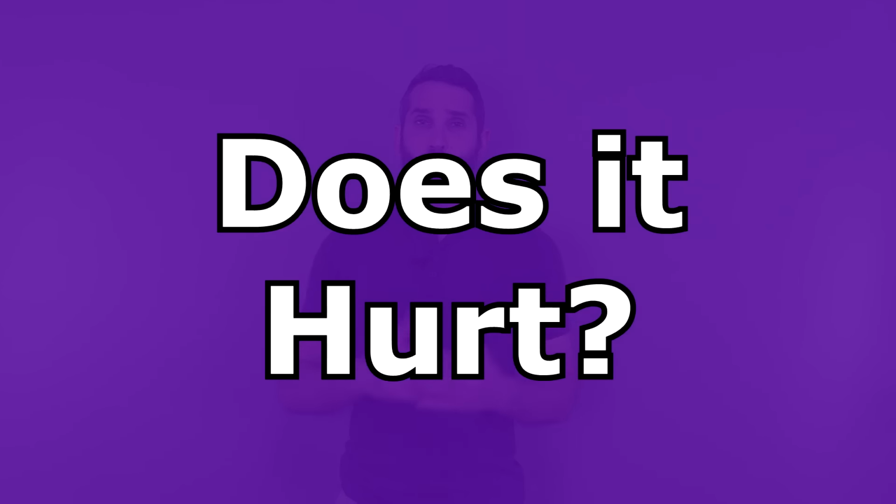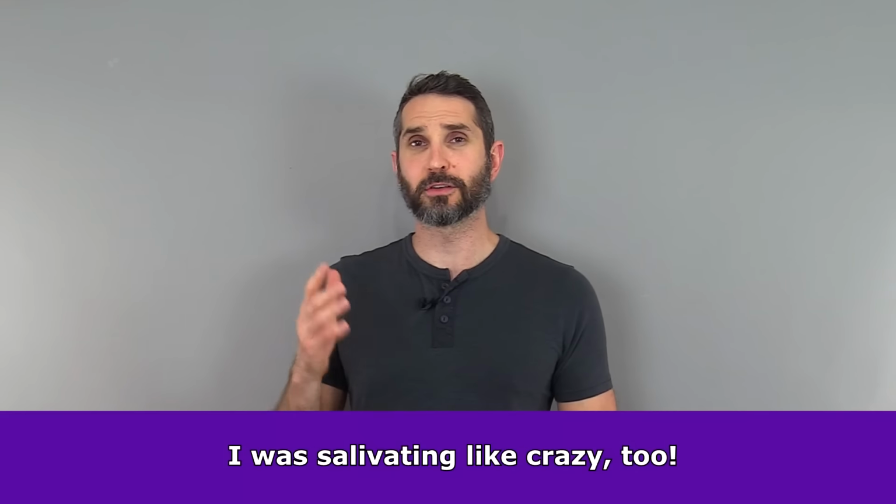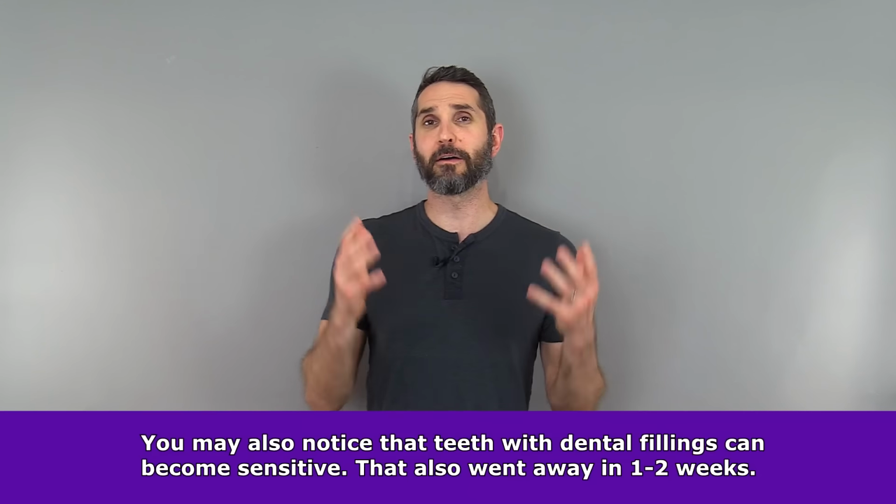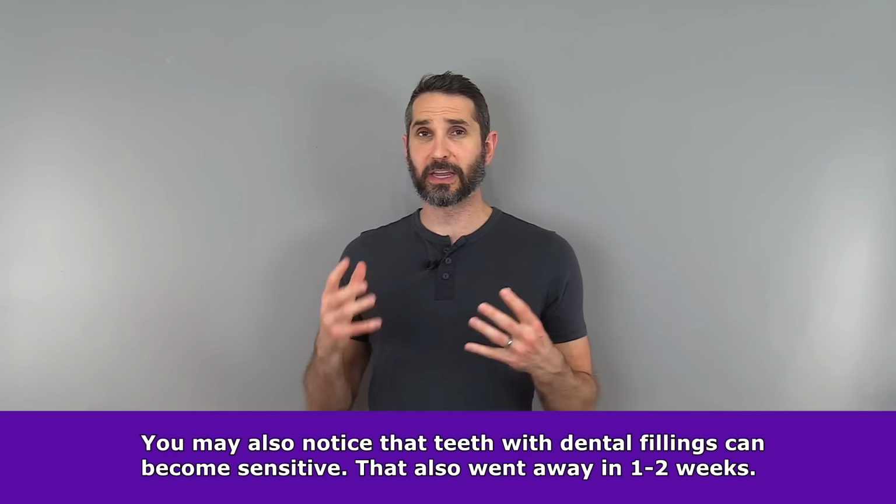Another big question that people have is, does this hurt? And the good thing about this clear aligner treatment is that they use a much gentler approach than traditional metal braces, but there is still some pain involved. The worst of it for me was definitely that first 4 or 5 days because my whole mouth completely freaked out. And I had a serious moment of regret where I was thinking to myself, this is the worst decision ever. But thankfully, after about 4 or 5 days, my mouth and everything adjusted, the pain began to subside, and things went so much more smoothly for the remainder of my treatment.